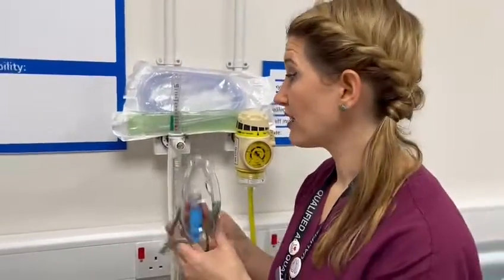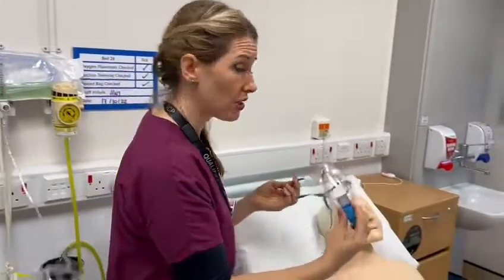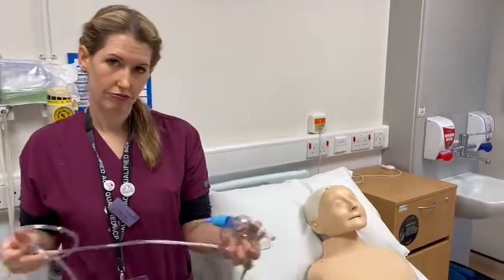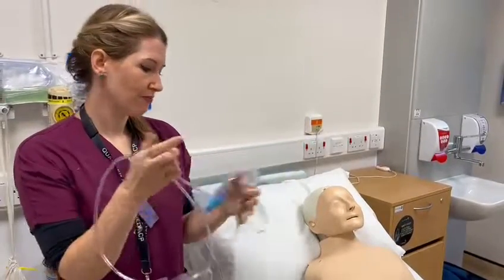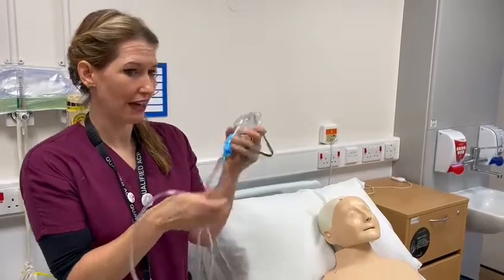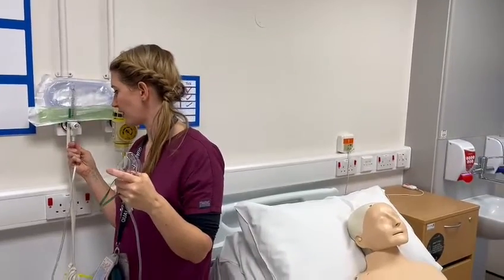Now I know that I've got the right amount of oxygen coming through, I would then go to my patient, explain what I'm going to do, and pop an oxygen device onto them. You have to make sure that you screw it on really tight — as you can see it can pop up, so it's always good to give it a really good press on.